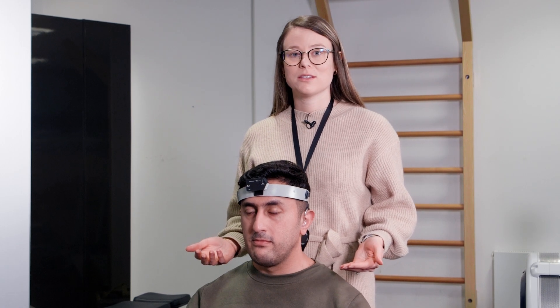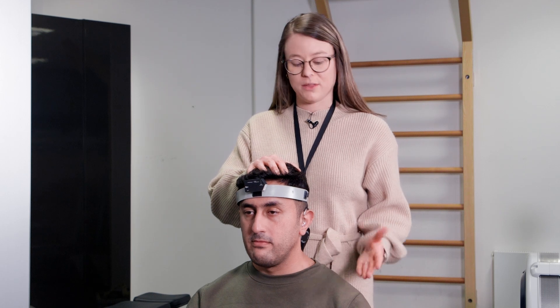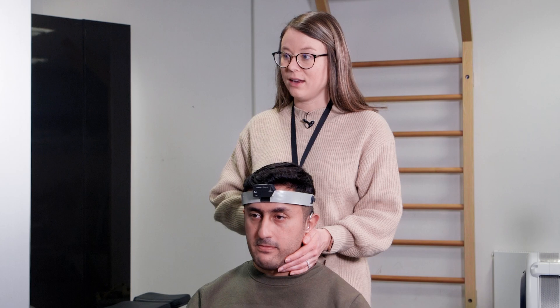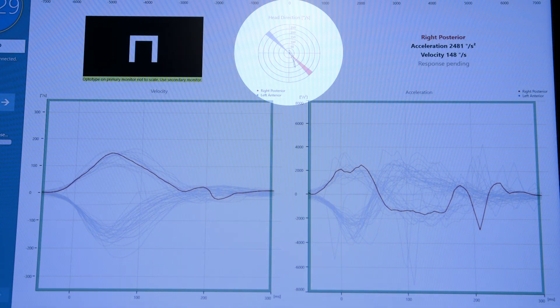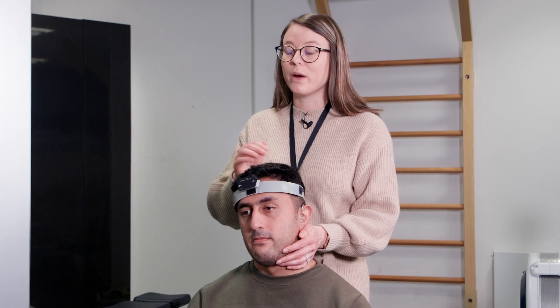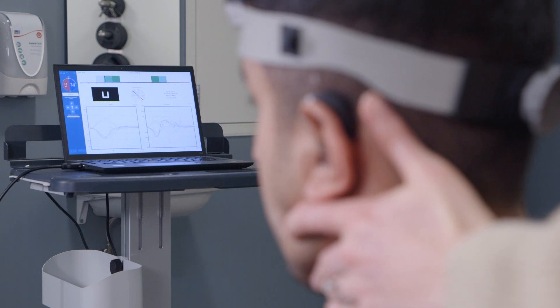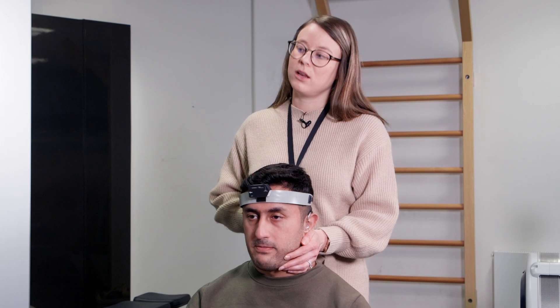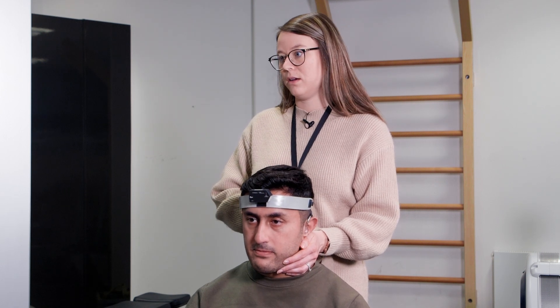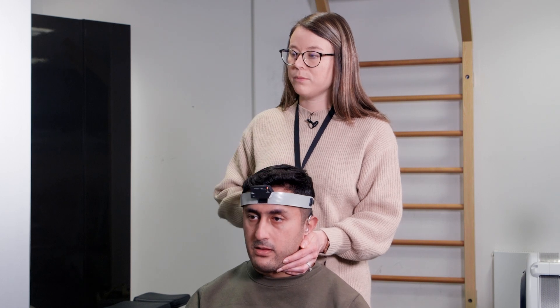Next, we're going to look at the vertical canals. There are two canal planes that we look at. The first one is called the left anterior, right posterior, or LARP plane. So you'll put one hand on top of the head, one hand under the jaw, and you're going to do a movement in that left anterior, right posterior plane. I'm getting feedback from the software on when I'm in the correct plane of movement. The patient always has their eyes looking towards the screen. I'm still trying to provide different speeds of head movement in this canal plane, and also randomizing when I go up and when I go down.